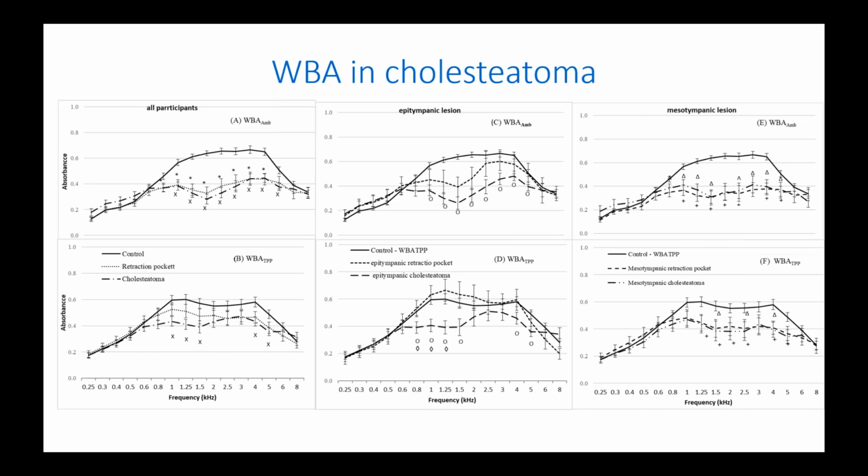Some of the middle ear conditions are quite well studied with respect to wideband absorbance, like eustachian tube dysfunction, middle ear effusion or otosclerosis. Whereas for some of the other conditions, we have very few case studies, or it's just emerging. We should remember that wideband absorbance is an emerging technology. We don't have answers to all the questions. We don't have a definitive pattern for all the middle ear disorders. It's just emerging, and probably in the next few years, we'll see a lot of literature coming about on different middle ear pathologies.